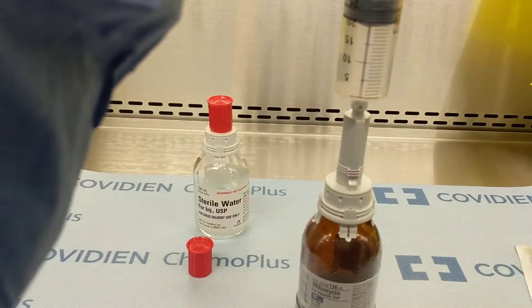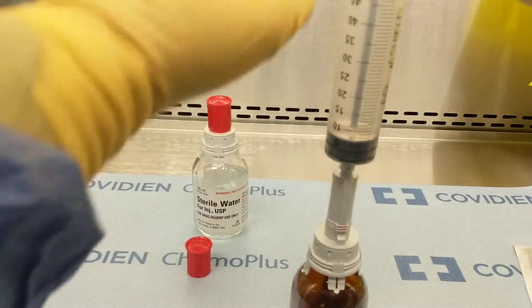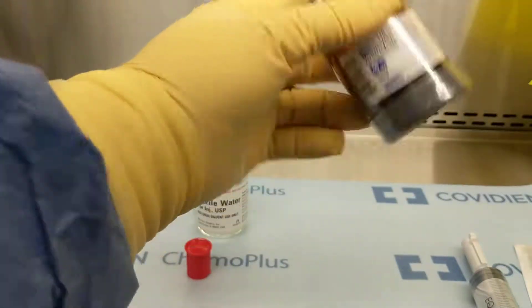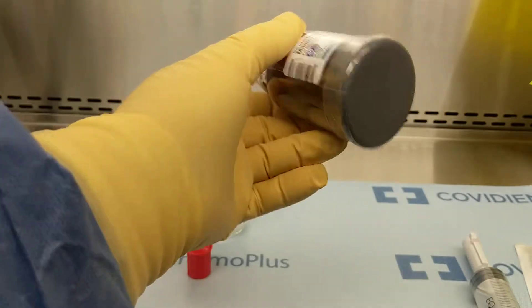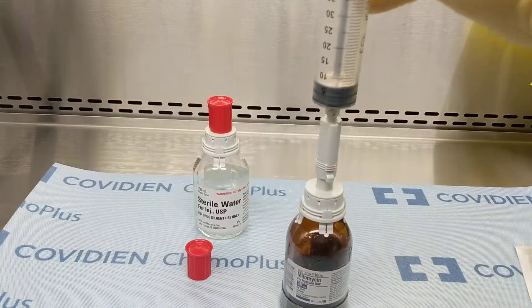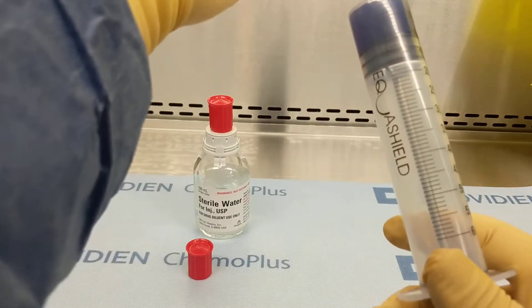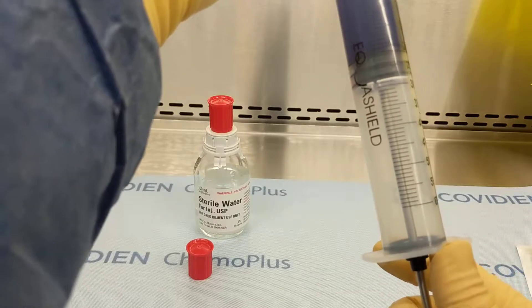Next, inject the 40 mils of sterile water into the mitomycin vial. Agitate gently to reconstitute. Then withdraw 40 milligrams of mitomycin in 40 mils of sterile water for injection.